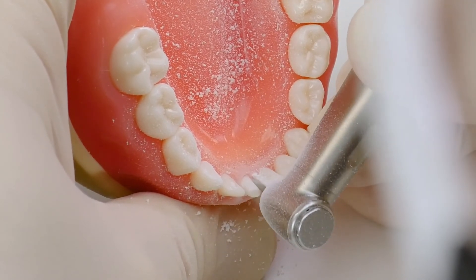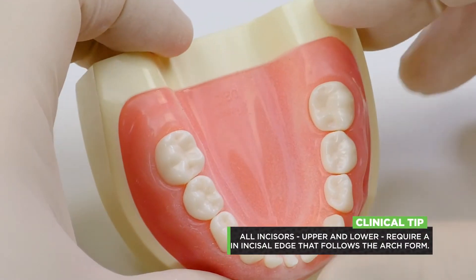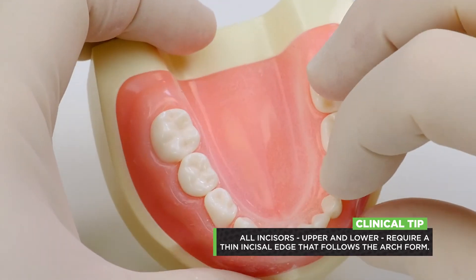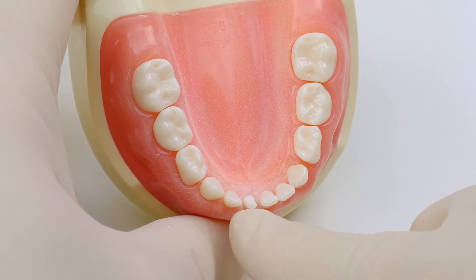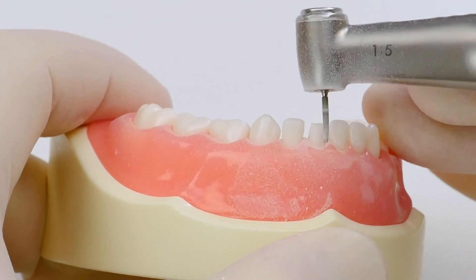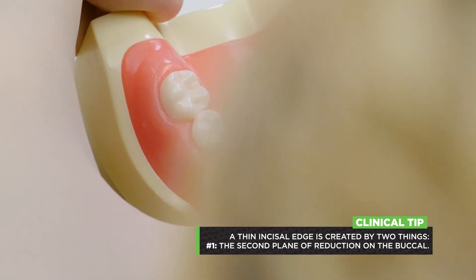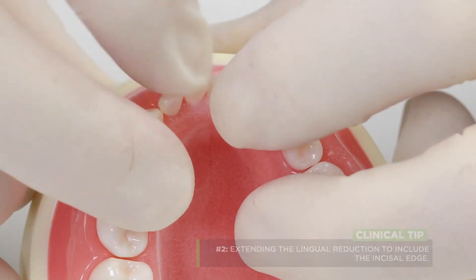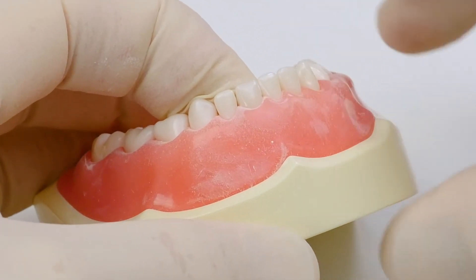That is it — that's my lower incisor reduction, and you can see the completed preparation there. You want a thin incisal edge that follows the arch form, same as with the upper incisors. Looking from the occlusal, my buccal reduction — I might need to take that in a little bit with that second plane of reduction, which we still do slightly on the lower incisors. I'll just roll that in just a hair. Now we have our thin incisal edge that follows the arch form — perfect. We can try our crown on, and if the shoe fits, it should fit perfectly. There's our completed crown preparation.